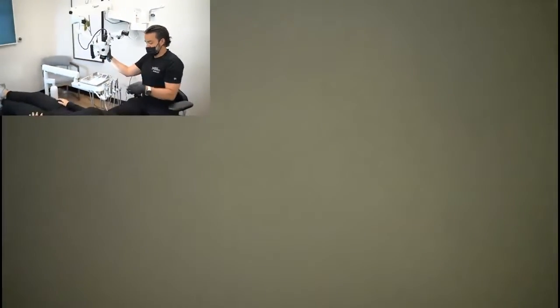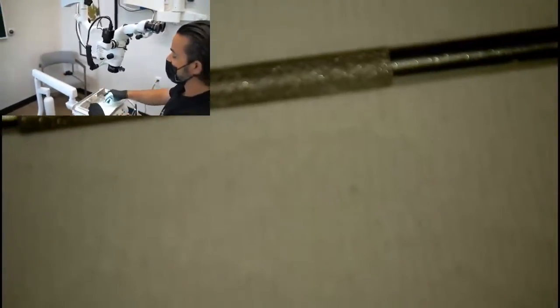All right. Let's see. Can we get some close-ups of those controls you're talking about? Yeah, whatever you want's fine. All right, so you can put a mirror, I can put something down. Let's just actually draw a picture.